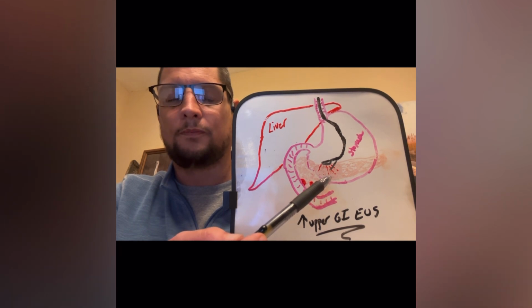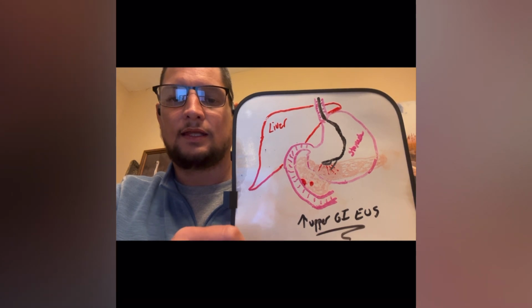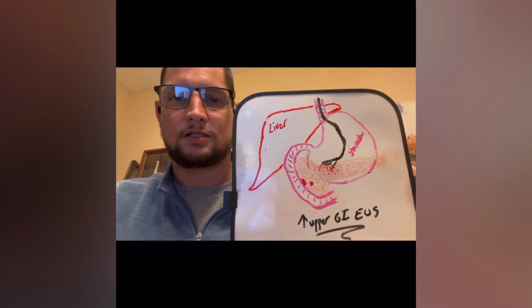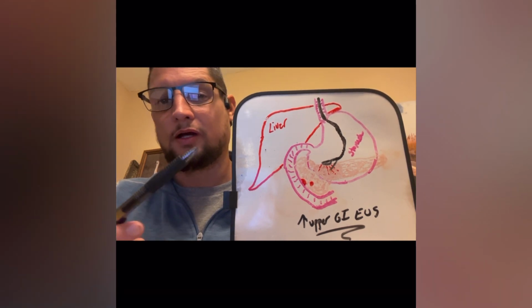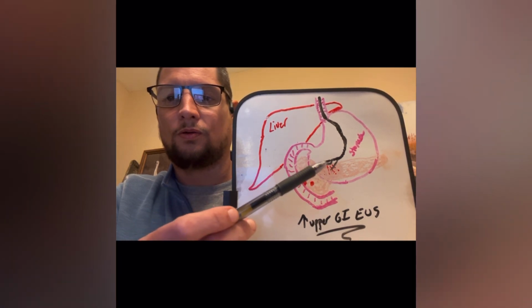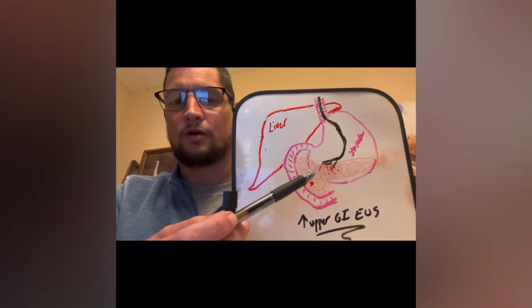Now, this fluid buildup happens because this patient has pancreatitis, and after being diagnosed with pancreatitis, they end up having pseudocysts. Sometimes these pseudocysts show up in our scans, such as a CT scan, and we can go forward with the EUS procedure and get a better look directly into what is going on, looking past the stomach, right into the pancreas.